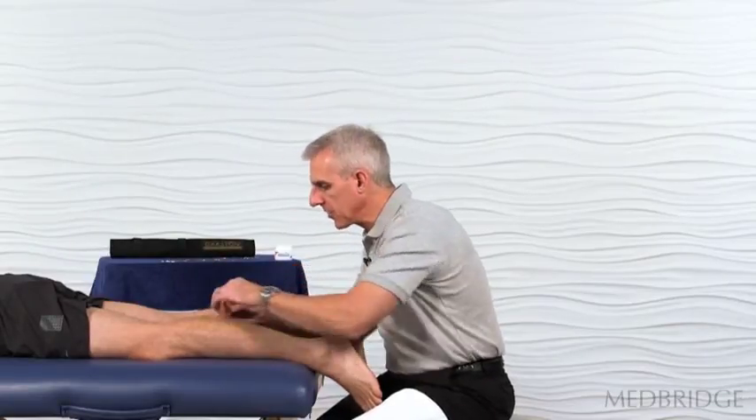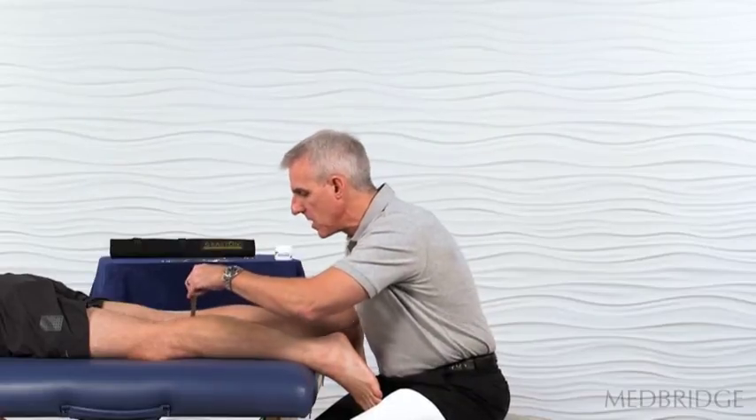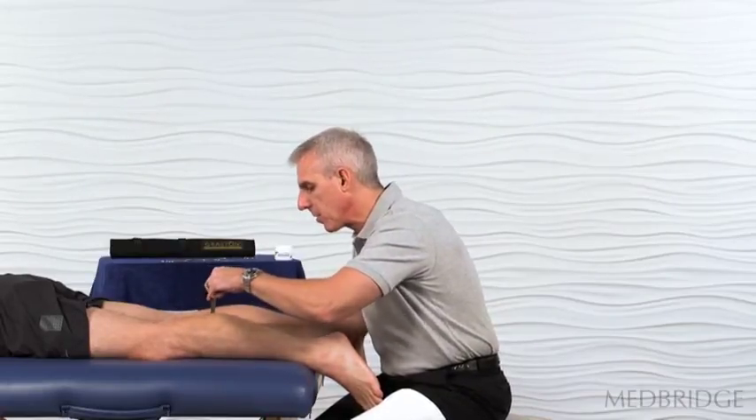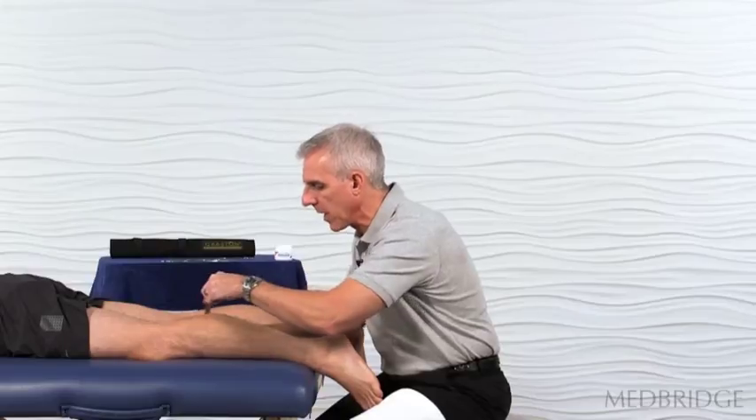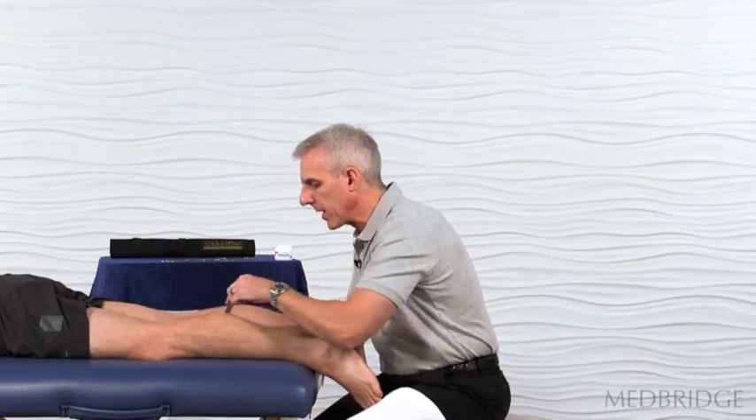Now where we find restrictions in this medial gastroc and maybe the interface with the hamstrings, we might start to get a little bit more aggressive — maybe increase the rate of our stroke, the speed of our stroke — and just try to mobilize that tissue.